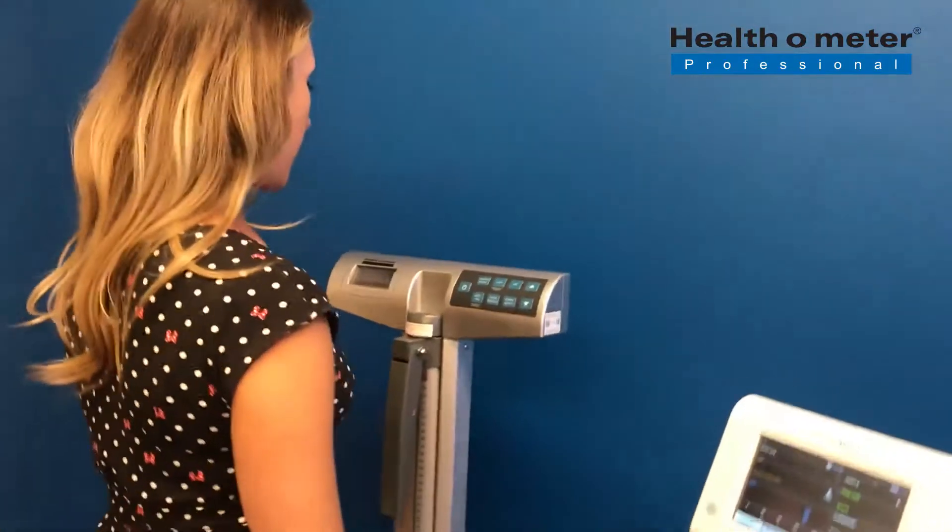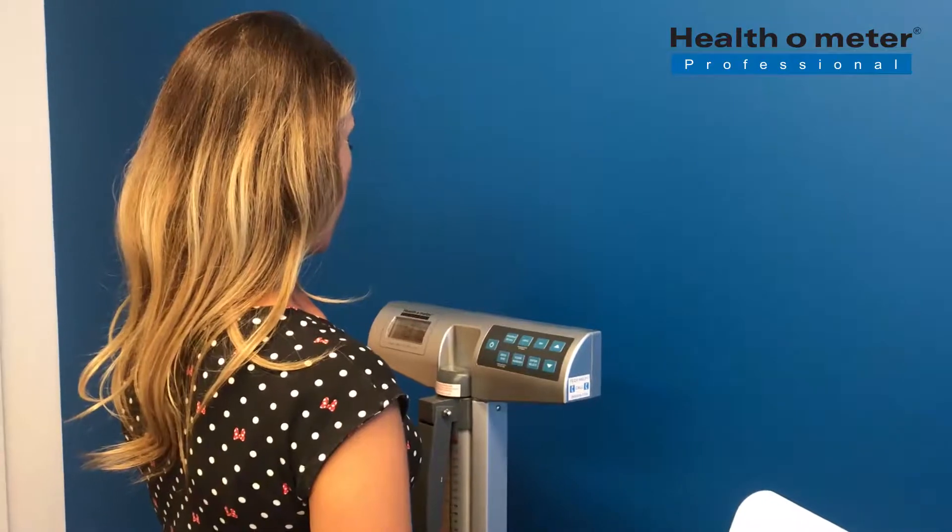Have the patient step onto the scale, and when the weight locks, it'll appear on the Welch-Allen Monitor.